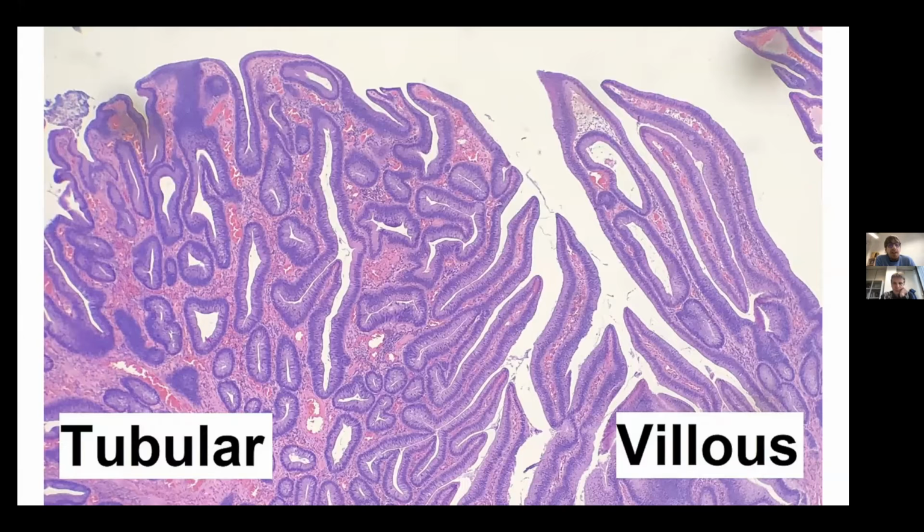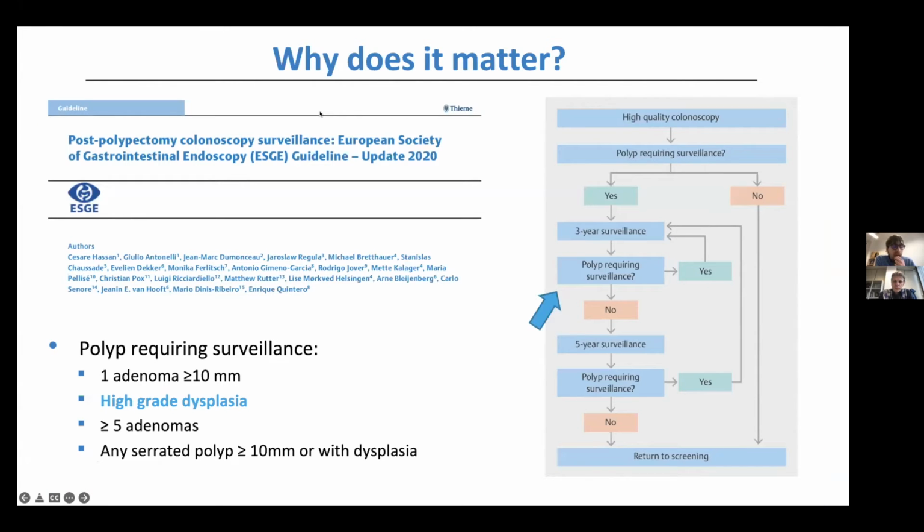But maybe we do not consider that for developing a deep learning analysis tool, it makes a complete difference if it has to approach the image at high power magnification or low power magnification. And sometimes the information you get from the analysis is not sufficient at one single magnification. So this is just to give you a background on which kind of images we have analyzed.